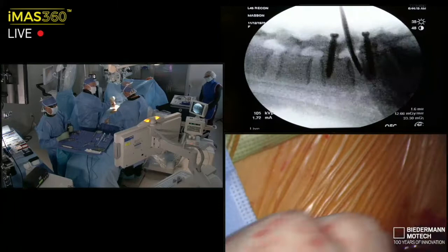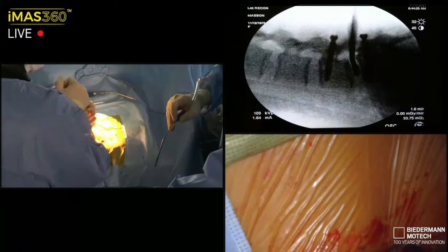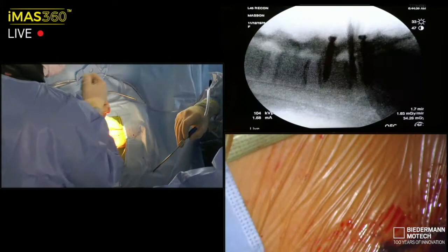Feel until I rough it. I don't want to gouge the end plate, for bone quality is excellent. Take it past the 50-yard line to the ventral disc. This is a high box cut. All right, found the hole easily, so my pathway into the disc is clear.